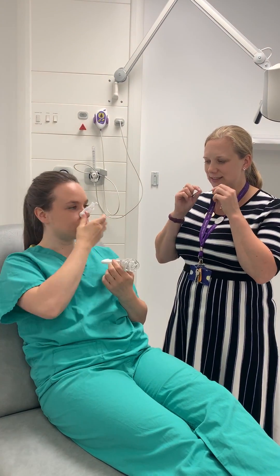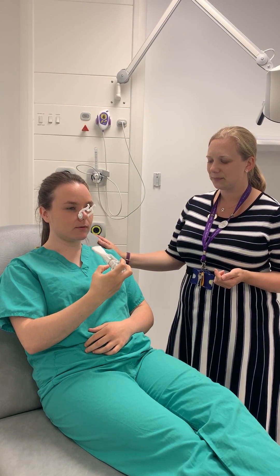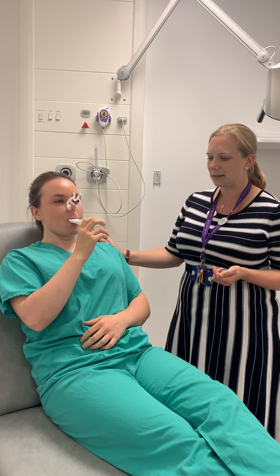You need a nice tight seal with your lips around the mouthpiece. So you're going to breathe all the way out, nice tight seal, a big deep breath in, deep breath in.